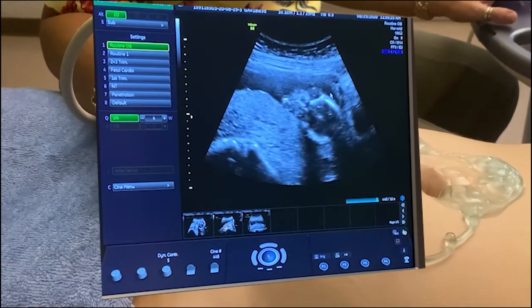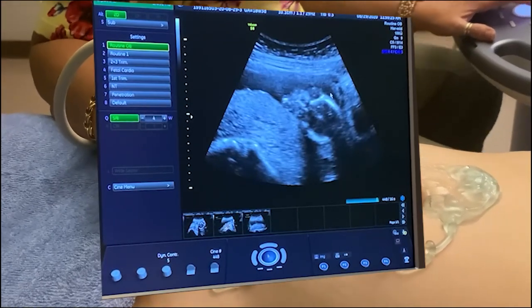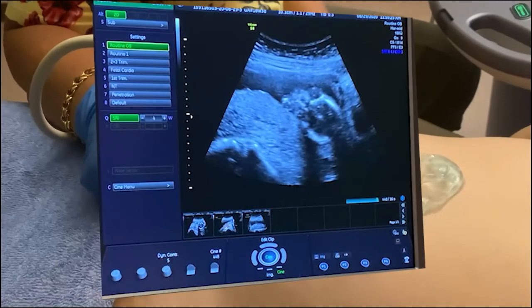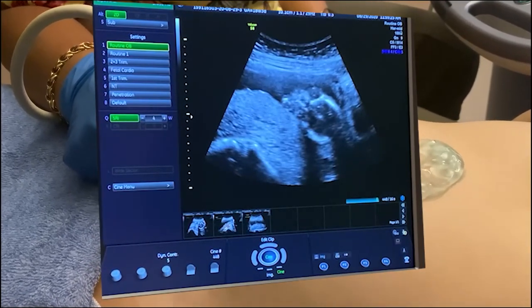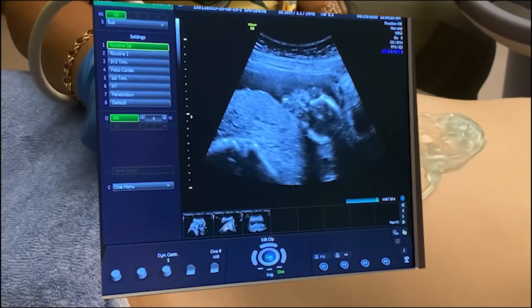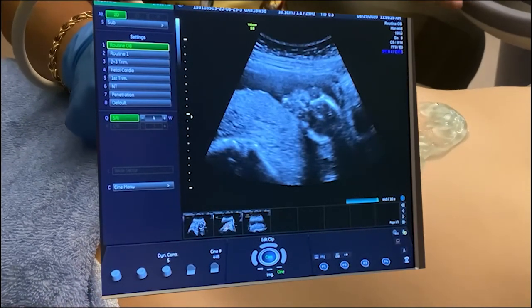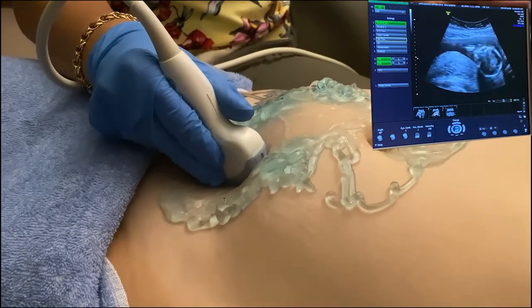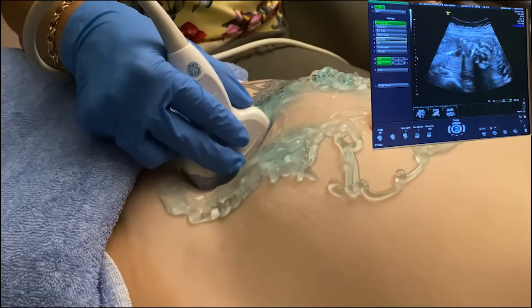And those are actually the lens of the fetal eye. This is very subtle, but here we can rule out quite simply congenital absence of the fetal lens, which is how some children can have congenital blindness. And we've just ruled that out simply by looking for it.